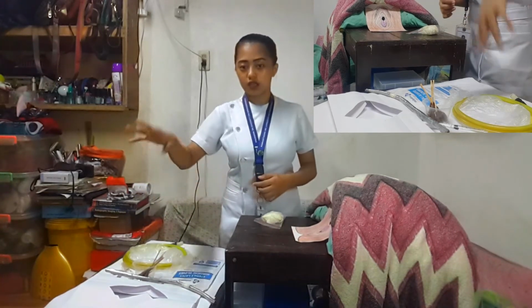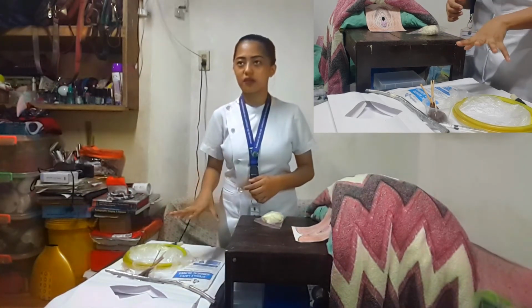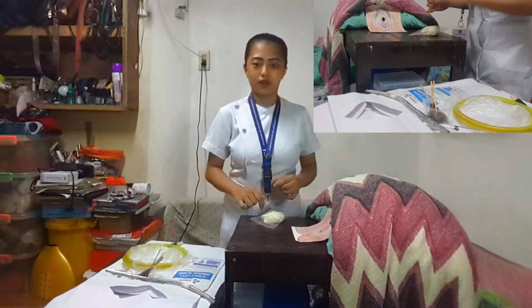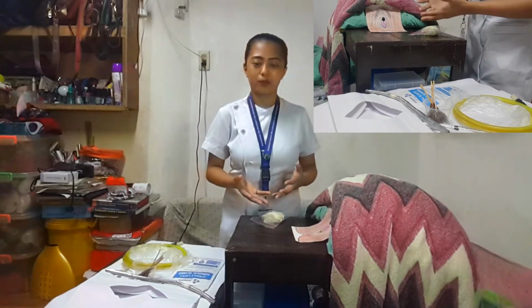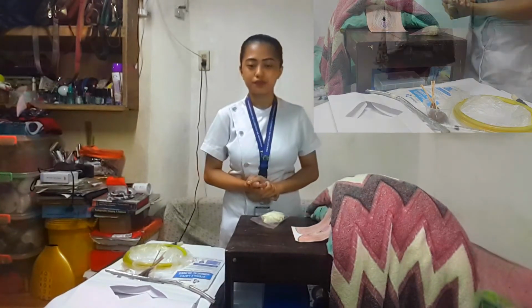All of these are sterile. Aside from these sterile equipment, we'll also be needing clean gloves for the preparation for the catheterization.